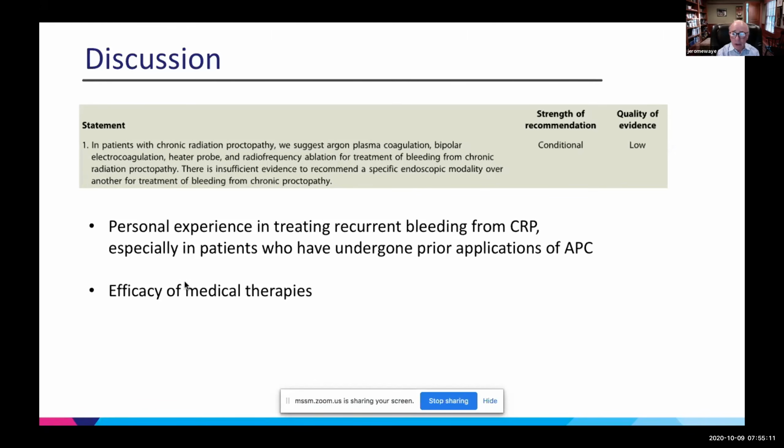I put the scope in and all I saw was stool. So I asked the guys who came with him what kind of prep he had. So they said he was so out of it that he couldn't drink any of it. So I scrooched around with my scope and saw underneath all that stool was a lot of bleeding. And it was obvious from radiation. So I thought, well, what the hell? He's here and I'll give it a try. Maybe I can do something.